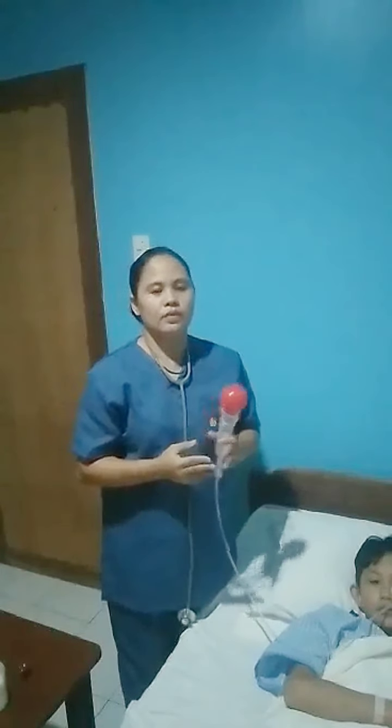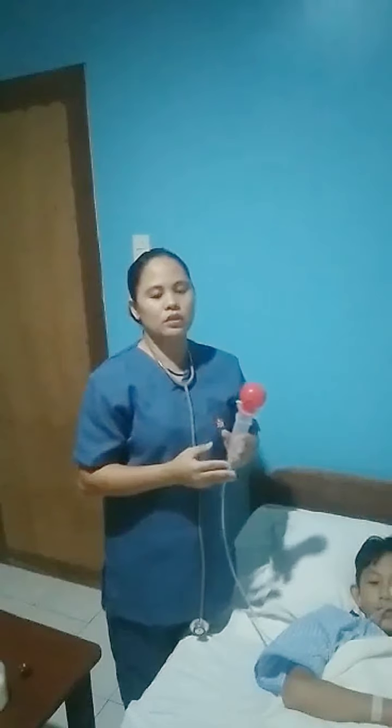Next, if you're using the syringe method, we should just hold the syringe manually, fill and refill again. Do not allow the water or formula to fall below the bottom of the syringe because that will carry air and cause distension. To proceed with the flushing, the same rule is applied.